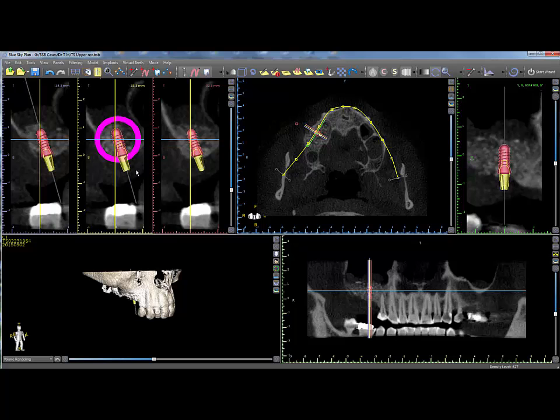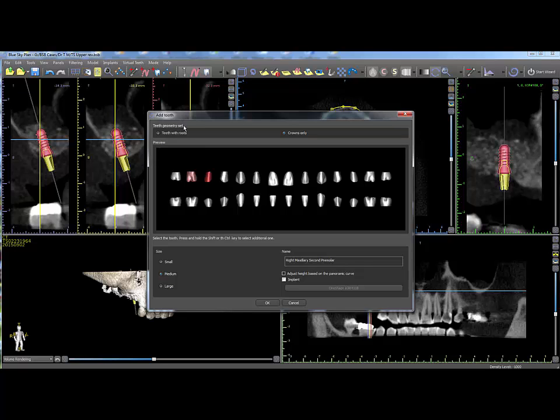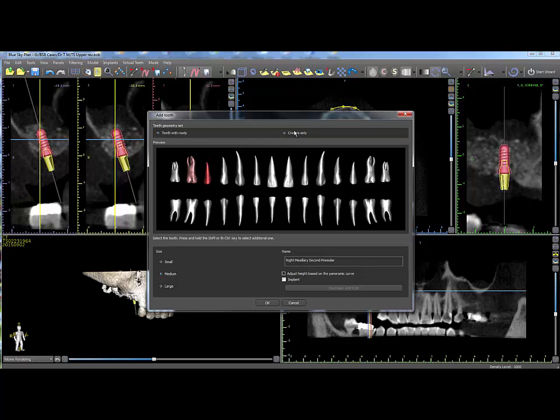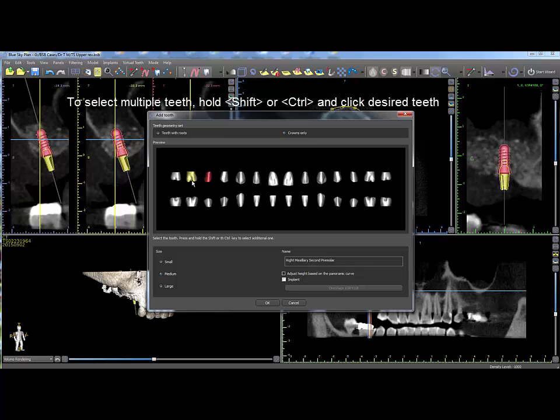To add virtual teeth, click on the Add Tooth icon. Select the correct geometry set, either with roots or without. Select the size, click on the desired tooth or multiple teeth by holding Shift, then click OK.